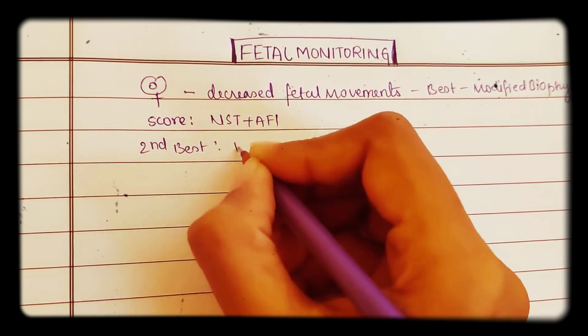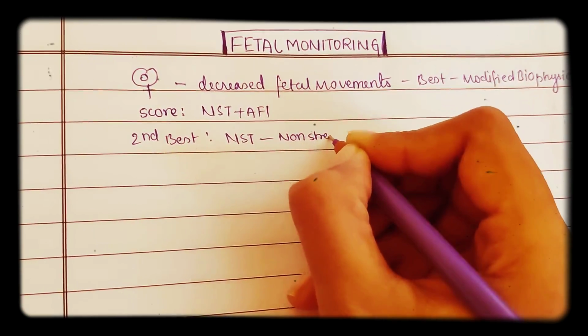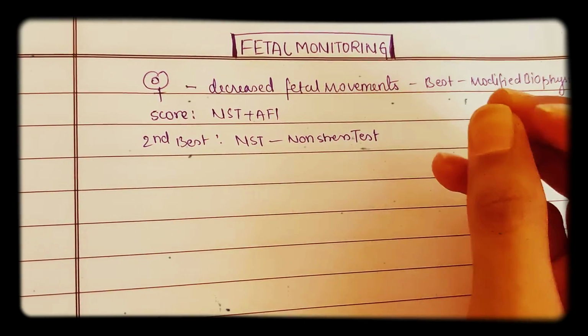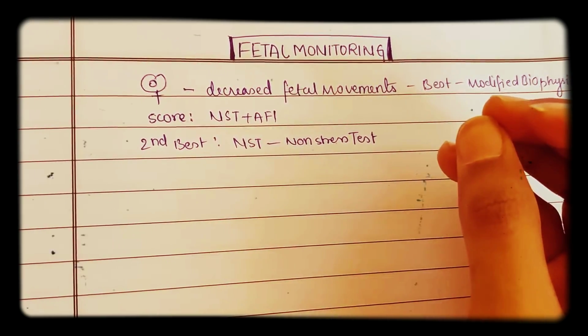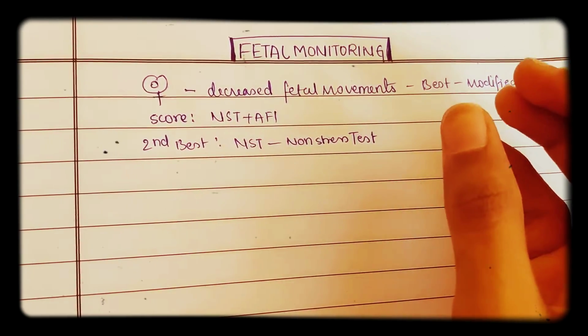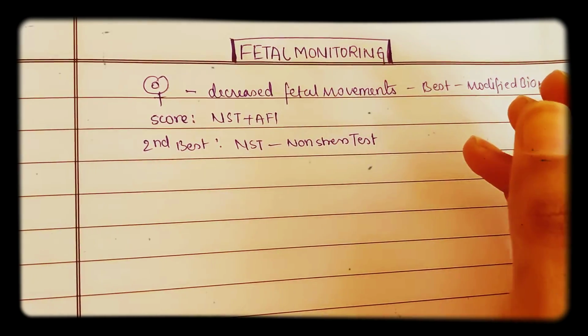is NST. Actually, what is this NST? NST is non-stress test. We call this test a non-stress test because here there are no uterine contractions in this period. So if we do the same test during labor, then at that time there will be uterine contractions. So that is called by another name, I'll say about that.